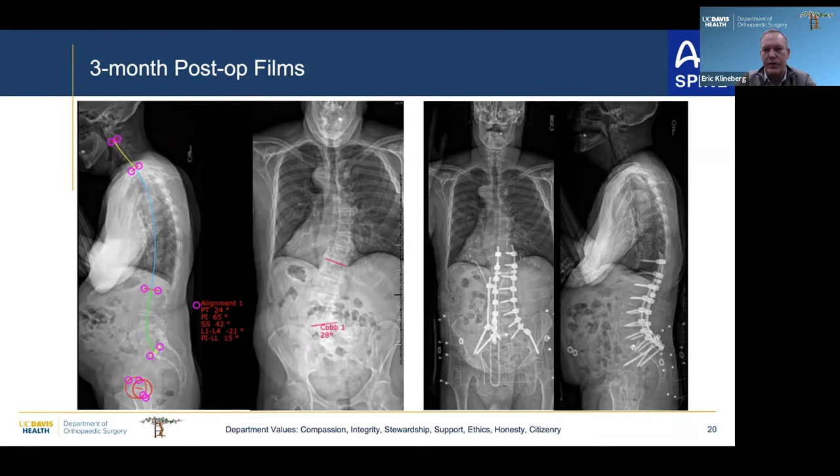So I see these folks at 5 years, and seeing a person at 5 years who then has a rod fracture and you have to take back to the operating room kind of sucks. So I've started using more implants down there, with those accessory screws and rods. I don't think it impairs a fusion rate, because I do the fusion before I put that final rod in, and then still get nice packing of bone in the posterolateral gutter.